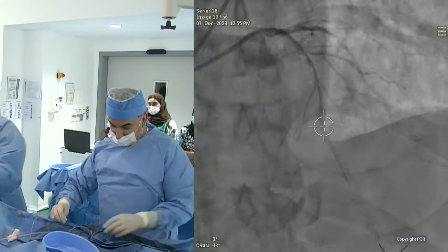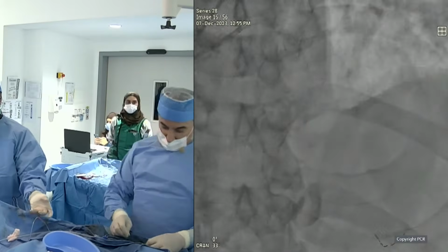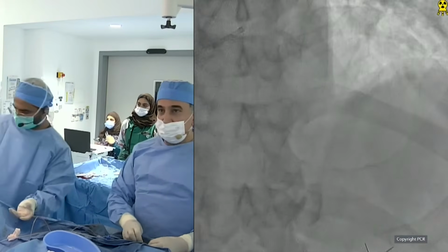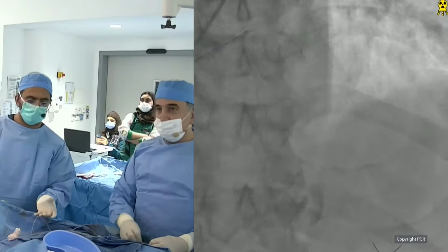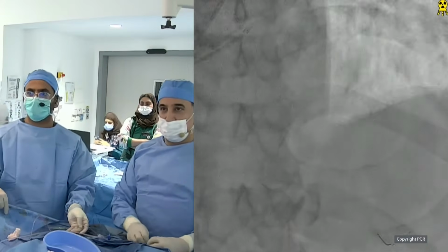So you're confident that you can dilate now? Did you test that, or? Yes, hopefully we can. And you're taking a microcatheter in to exchange the rota wire for a standard wire and then rewire the diagonal, and then you've got proper guide wires in both vessels. Okay.